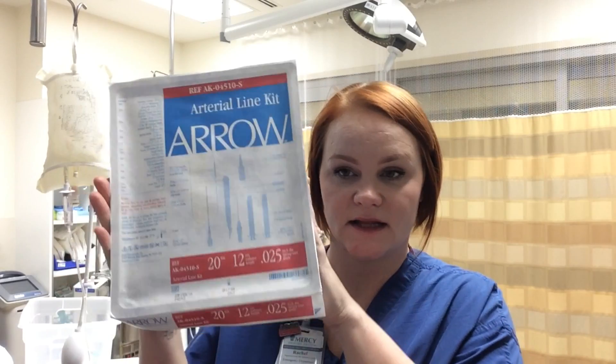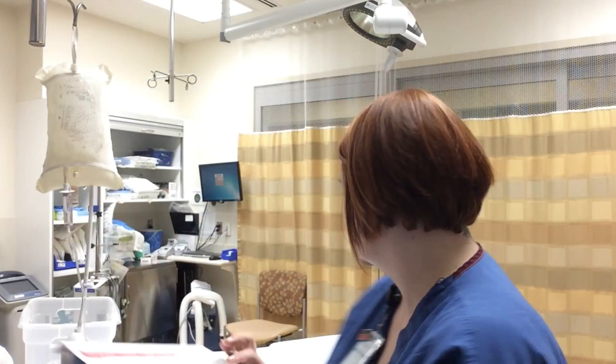When the physician orders the arterial line, gather the supplies they'll need — it takes them a little time because they have to don their PPE: mask, gown, and hat. You'll need an A-line kit, kept in the bottom drawer of the central line cart, and your pressure tubing. You can get either a single or double package. In the ER we really only need a single; the double is used in the ICU to monitor CVP or other pressures.